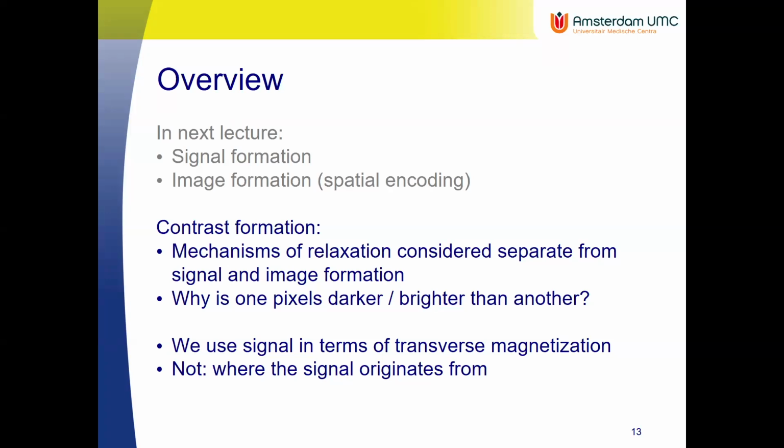And there we are again. You are going to play with the virtual MRI scanner and play with the settings of repetition time and echo time, and produce the things I'm going to explain now. You're going to play with that yourself. So we're going to look basically at the process after I did the excitation. The spins are going to relax, return to their equilibrium state. That's where the magic happens.